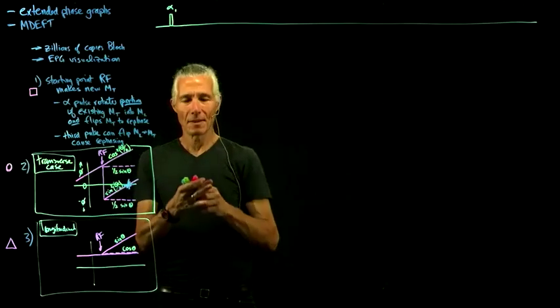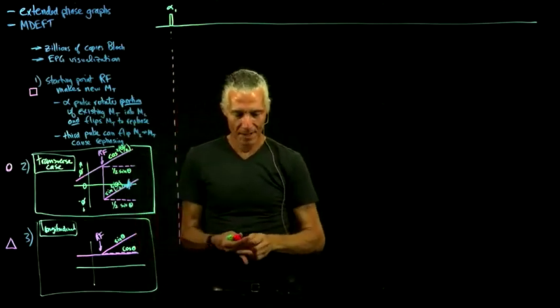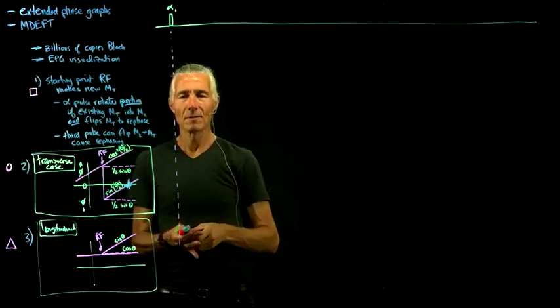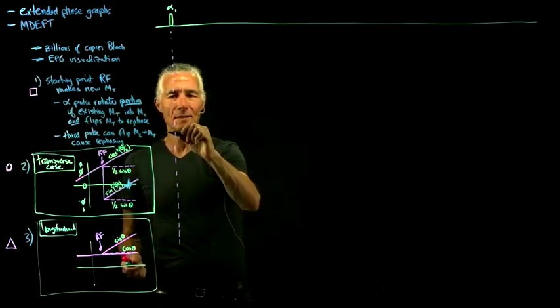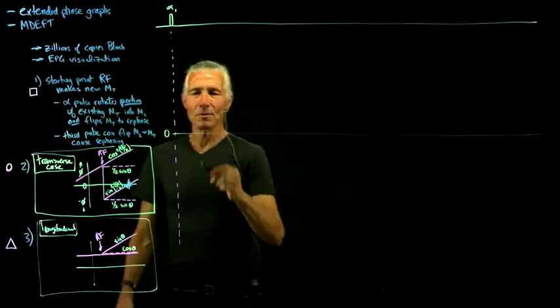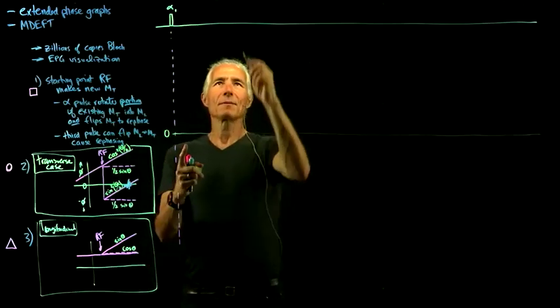So okay, here's our first RF pulse. We've waited a long time. There's nothing going on, nobody home. And so let's put our 0 on the phase diagram here. That's all good.